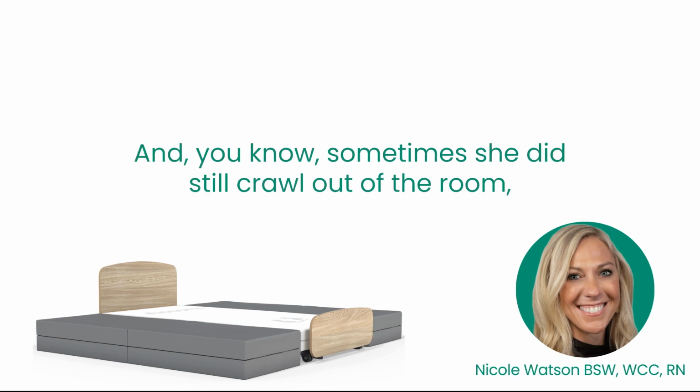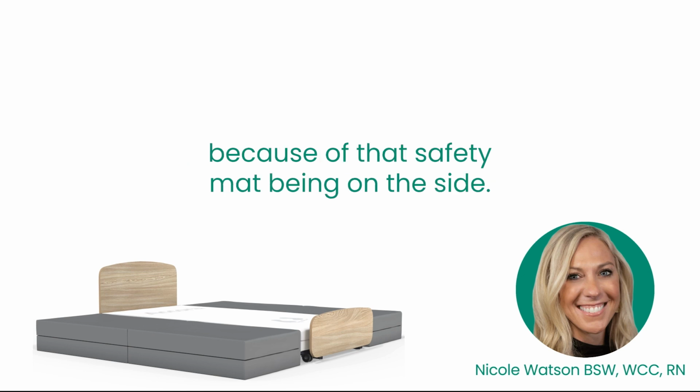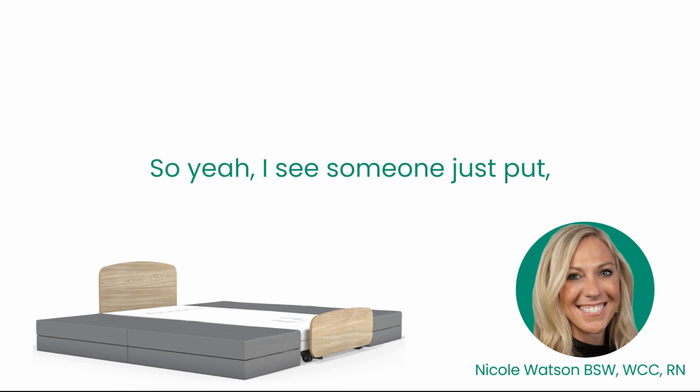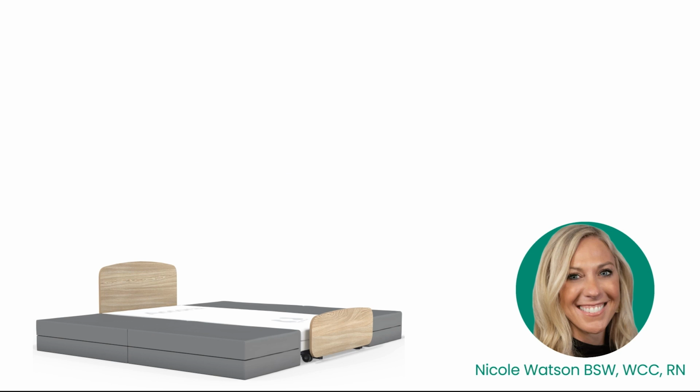Sometimes she did still crawl out of the room, but her sleep improved. I think it's because of that safety mat being on the side, and then she was getting out on the other side. So what did we do? We put a safety mat on the other side. So yes, I see someone asking, can you put them on both sides? Absolutely. You absolutely can.